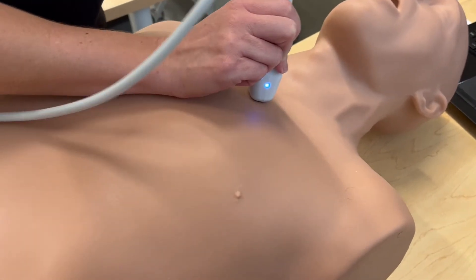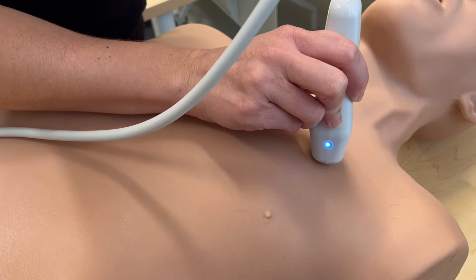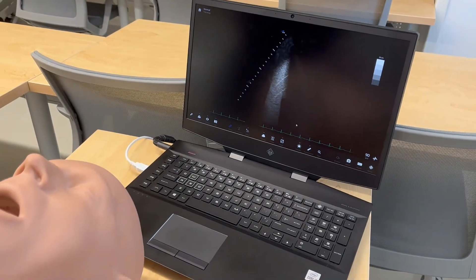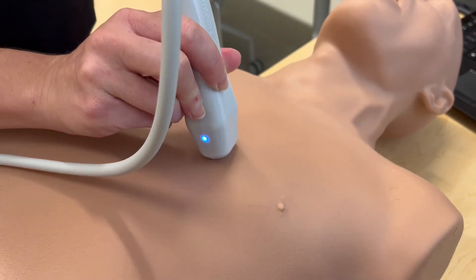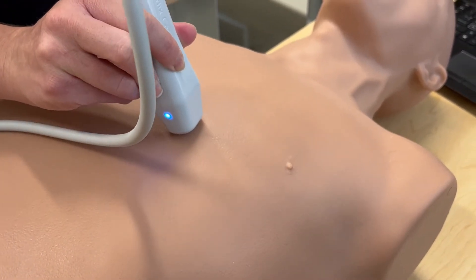We're going to continue to move the probe until we see the heart, starting next to the sternum and moving out laterally. If we don't see the heart at that rib space, we'll move down a rib space, back to the sternum, and move out laterally again. Repeat this across the anterior aspect of the chest until you obtain the parasternal long axis view.